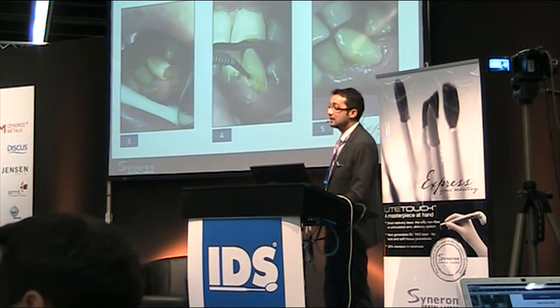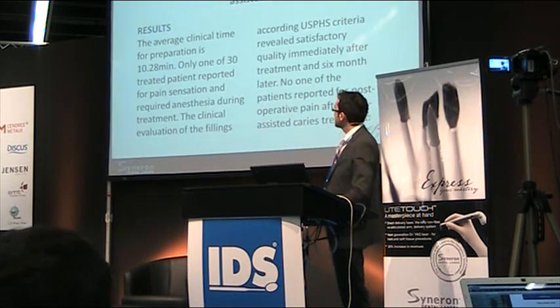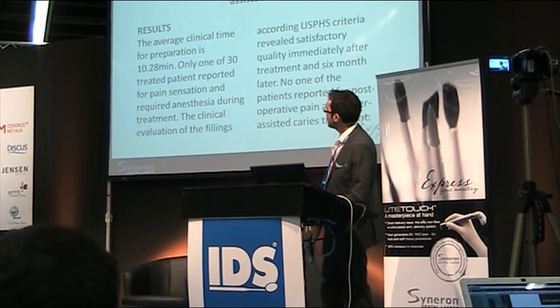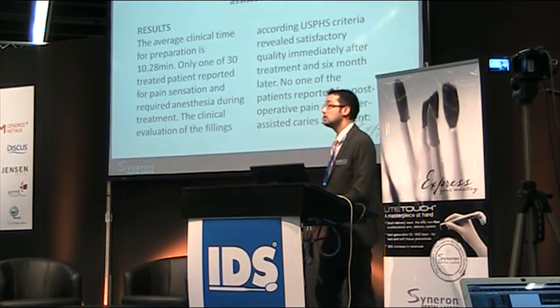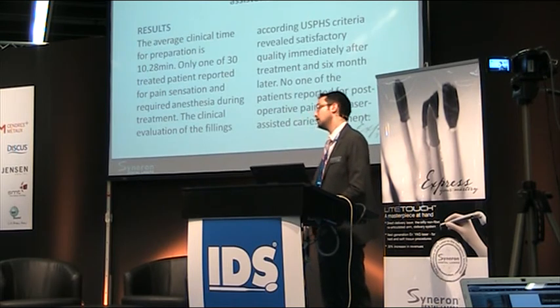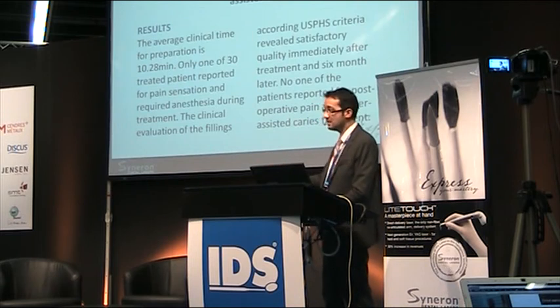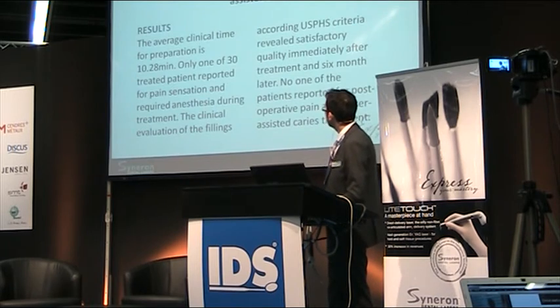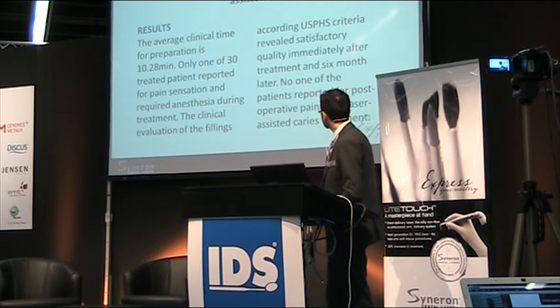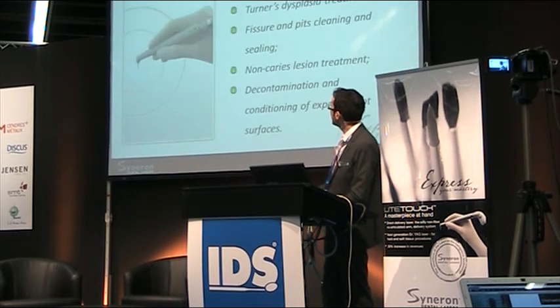We apply the adhesive agent without etching and the final restoration. So the results are that the average clinical time for preparation is about 10 minutes. Only one of the 30 treated patients reported pain, and it was necessary to provide additional anesthesia because the caries was very deep and near the pulp chamber. According to the USPHS criteria, the quality of the fillings was excellent, and no one reported post-operative sensation. This is also very important.